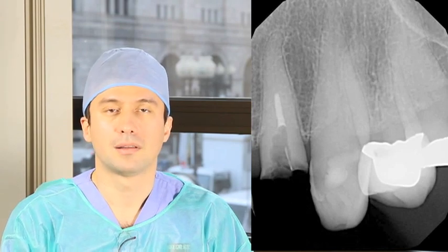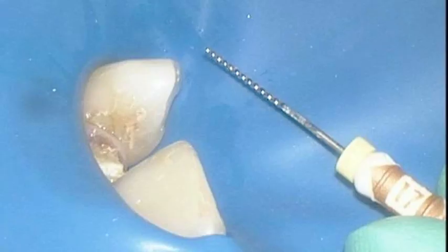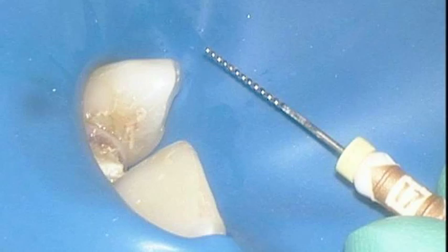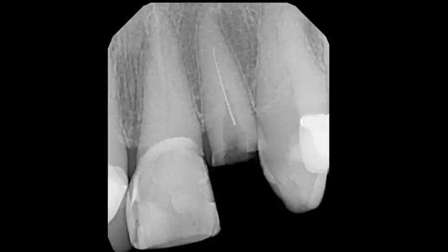Using this technique and checking multiple times while progressing down the canal, the canal was finally located at about the mid-root level. Unfortunately, a defective rusted number 17 flexo file failed immediately after insertion in the canal during a mere watch-winding motion. The failure was at the mid-shank level and was later determined to be due to rust in that particular area of the file.